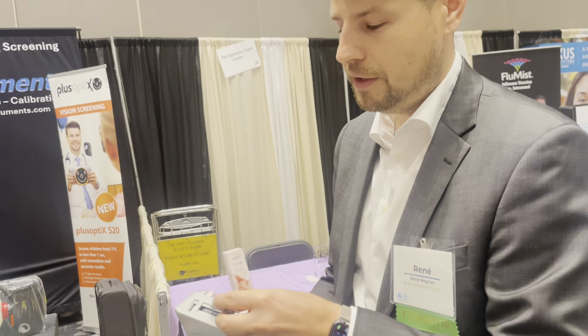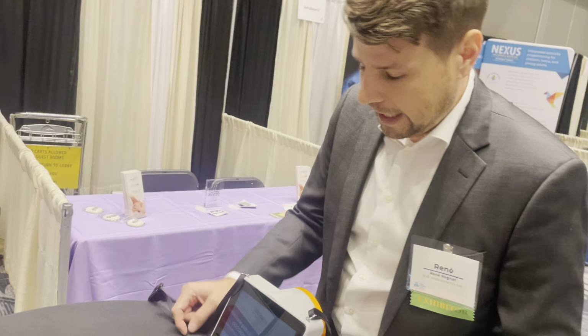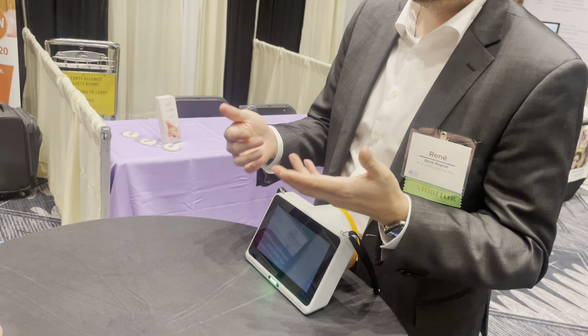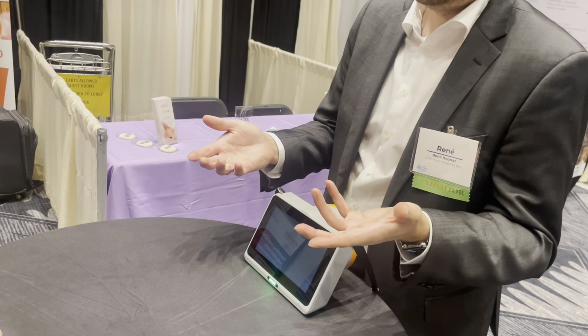Now, turning it on, it's easy. We're using this button here. We push it once, and this button illuminates green because it's also your battery status. So green means it's fully charged, yellow means 25% left, red means 10% left, off means your device is out of battery. Okay. The boot process takes about 15 seconds. Spot takes about a minute. Our previous devices take about a minute.